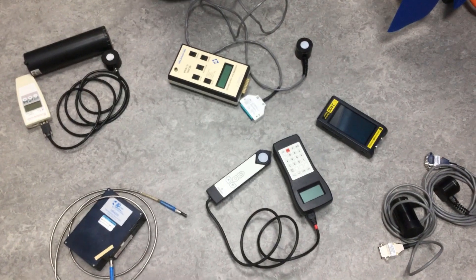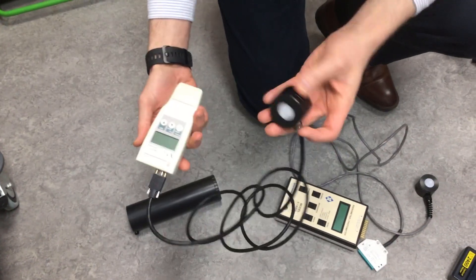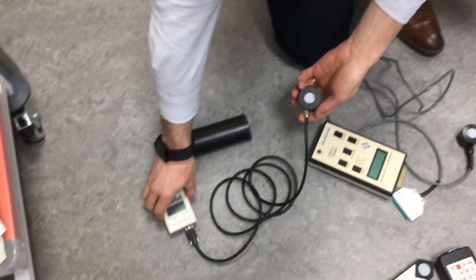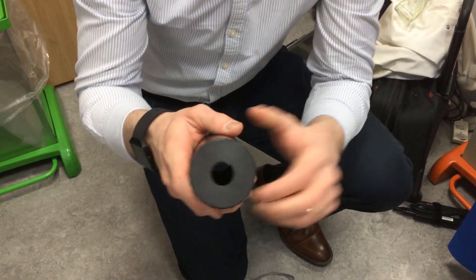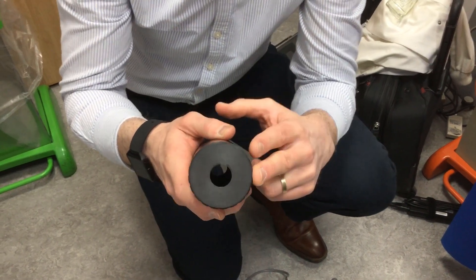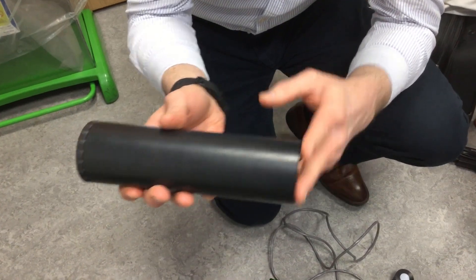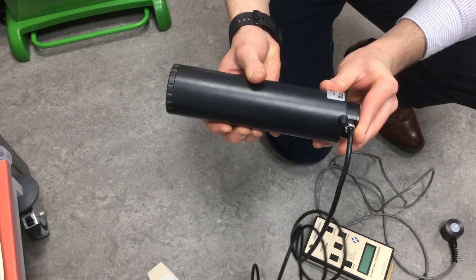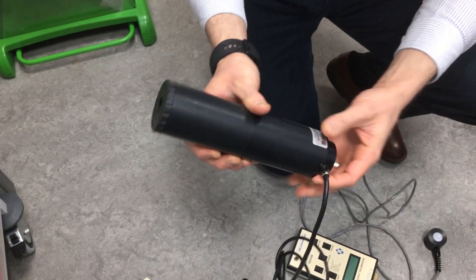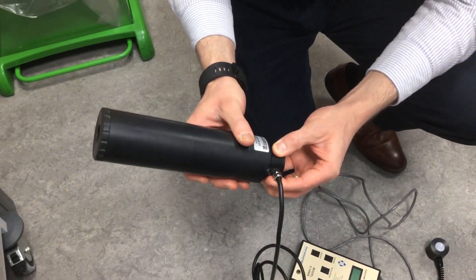Gigahertz Optic is another supplier. They do systems such as the Unique here. This one in particular also comes with a radiance attachment — a tube 200 millimetres in length with an aperture at the front, which limits the solid angle that the detector views when slotted into the end of the tube. That is required if you want to measure radiance rather than irradiance, but that's another topic entirely.